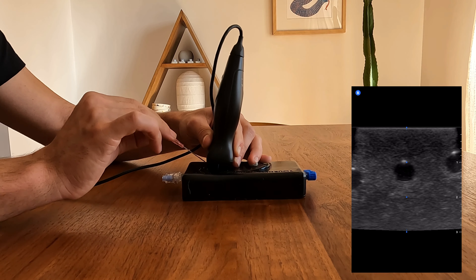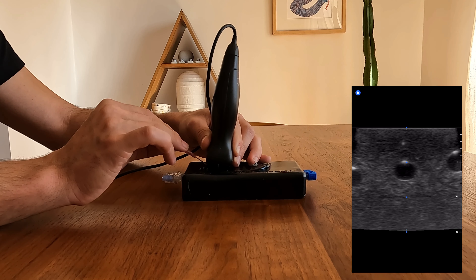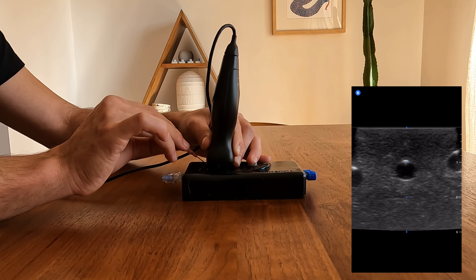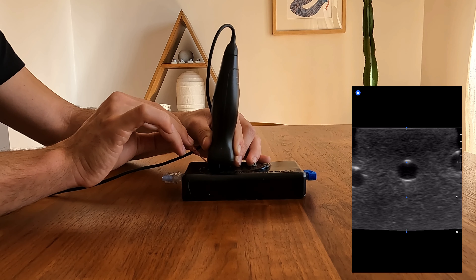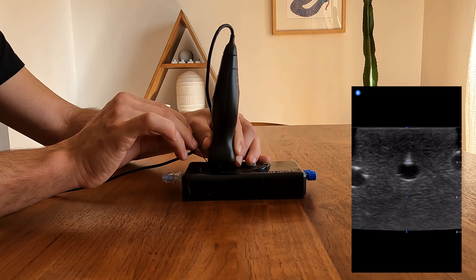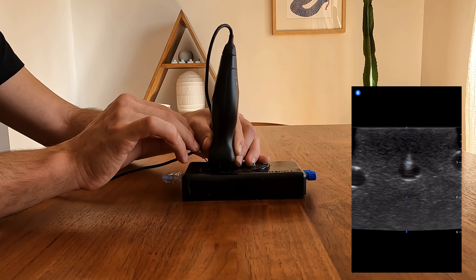Notice that I'll place the needle just under the probe at approximately 45 degrees, and as soon as I see my needle tip on the screen, I'm moving the probe slightly away from me. Notice I'm doing these sequential movements — probe away from me, needle away from me — kind of back and forth with really micro movements until I just get into that vessel.